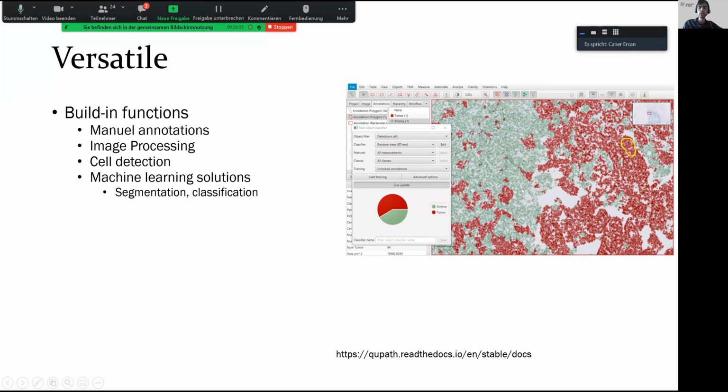And this classification is quite interactive. If you are not satisfied, or you are spotting any errors, you can put more annotations, and then you can improve the AI model, and you can see the live results updated here quite efficiently. Of course, if you are working with very big data, this step can be a bit slow, but besides that, it's going very well. Besides, you don't only need to work on the same slide for this. That's the beautiful part of working in the project.